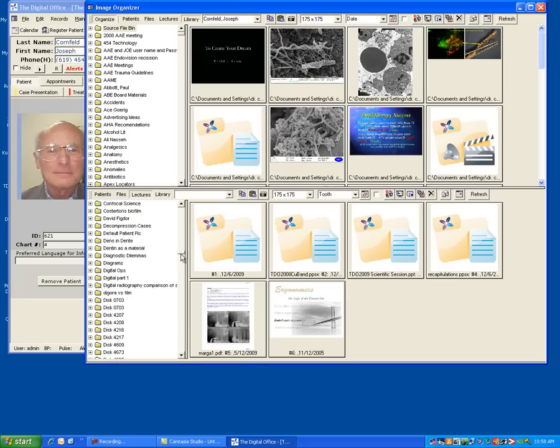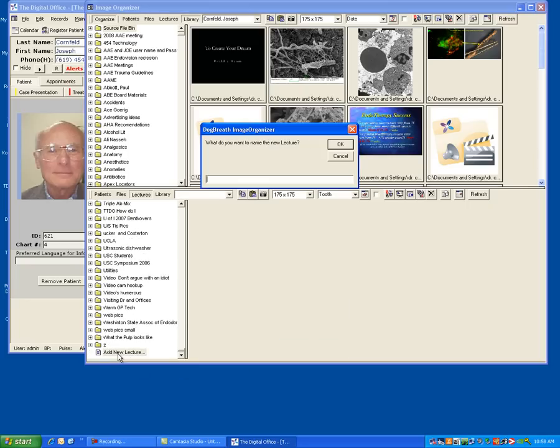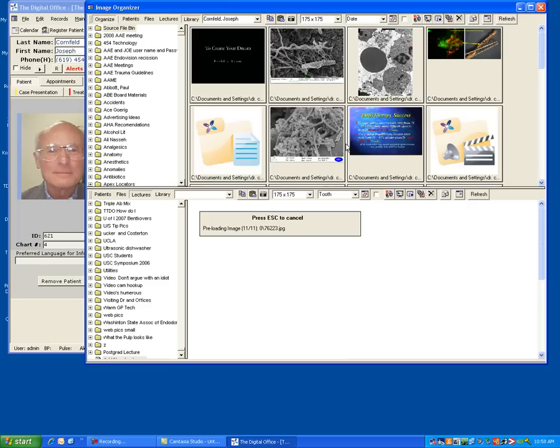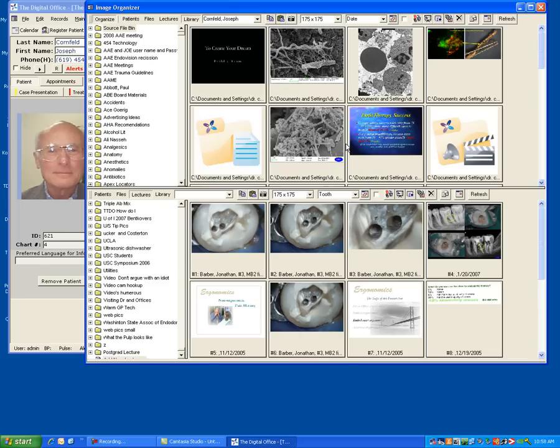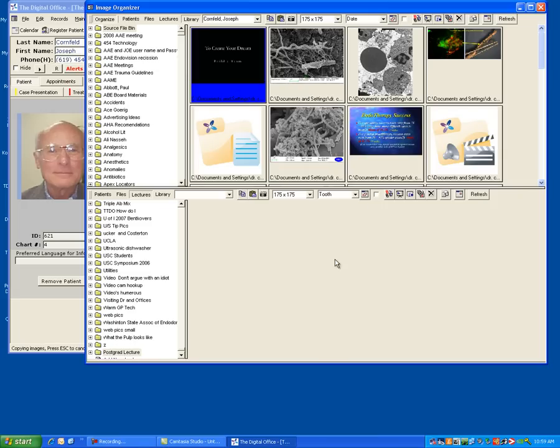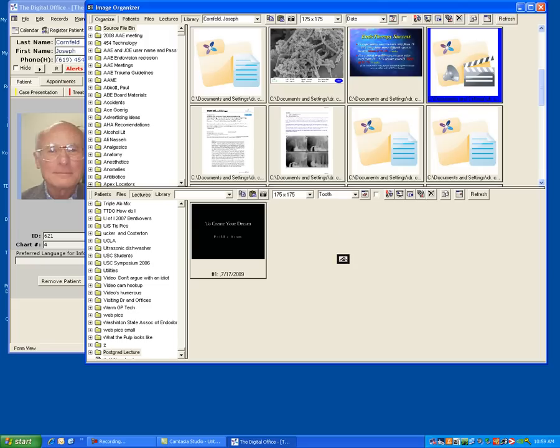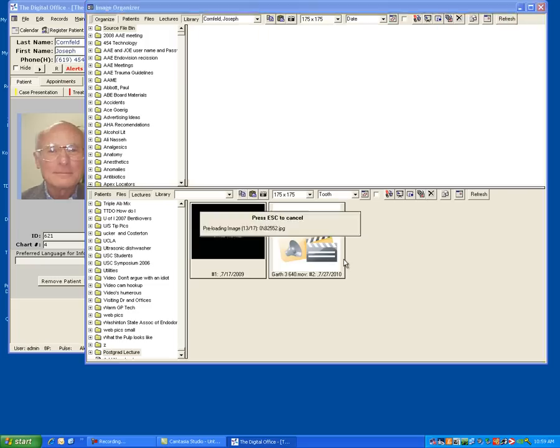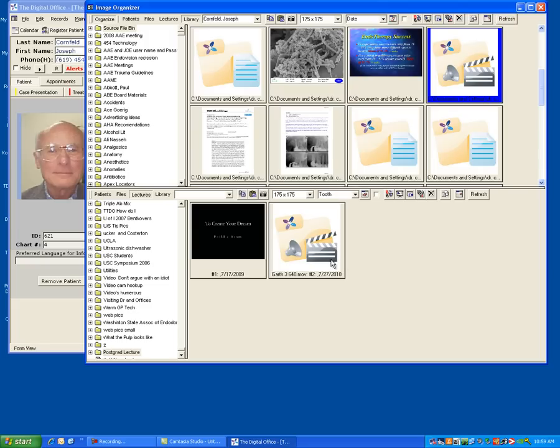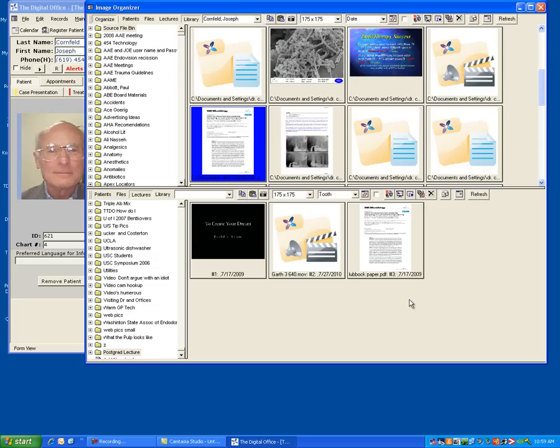I'm going to scroll my list to the bottom and create a new lecture. And now I can start creating the lecture by taking items from any of my library folders as well as any of my patient files. I want this JPEG image. I'm going to drag that down. I want this PowerPoint presentation. I can bring my PDFs. I can bring my movies. I can bring my Excel spreadsheets, Word documents, any of the file types that we already discussed.